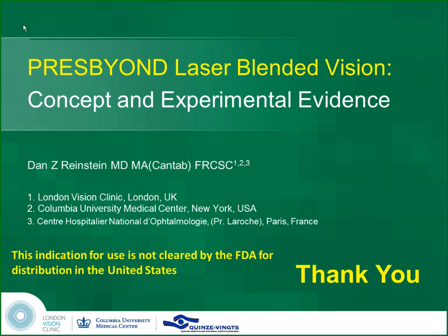We're still discussing the... Yeah, sorry. Now, back to the high myopic treatment, because I'm still not convinced, and I will never be convinced, that you can show me a patient who had a LASIK for -10 or -12, and you can have a cornea that is prolate over the 7 millimeter pupil, and that he can have the same quality of vision after LASIK that he can have after a phakic intraocular lens. I know in North America, I'm not sure in the UK, in North America the big phakic IOL are not a big thing, but maybe they don't know what they are missing.